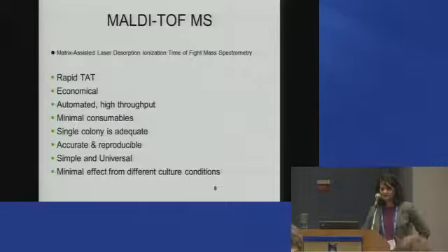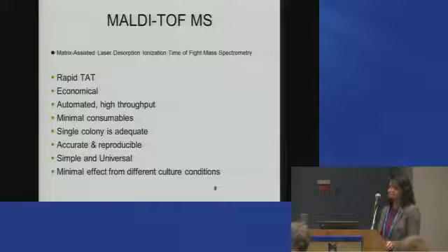So MALDI-TOF mass spec, right up front, I'll tell you the bright points. Rapid turnaround time, okay? We're talking minutes here, and I'm sure you all are used to it. I was a little amused when I was listening to a couple of speakers say, oh my God, 10 minutes in the lab is too long an assay. We need to cut it down to less than 10 minutes.